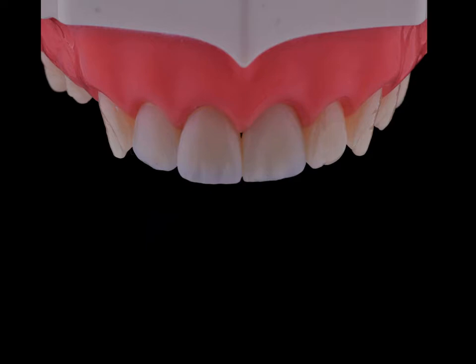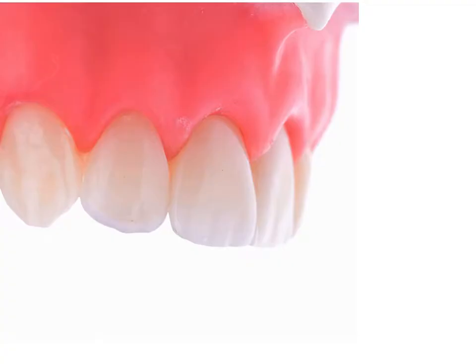The companies want to make it more simple for us, and they create composites that look beautiful even in one layer. And because the Uveneer gives you different thicknesses of composite in different areas of the template, in many cases, with one layer of composite, one shade, you can see a lot of shades because of the different thicknesses in different areas. And this is when we finish.